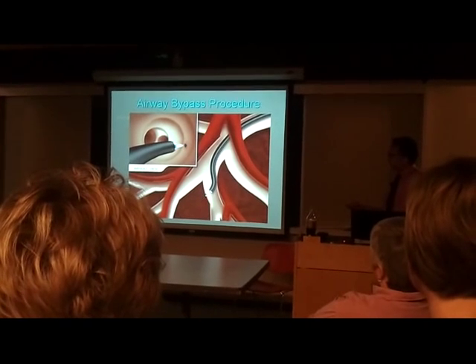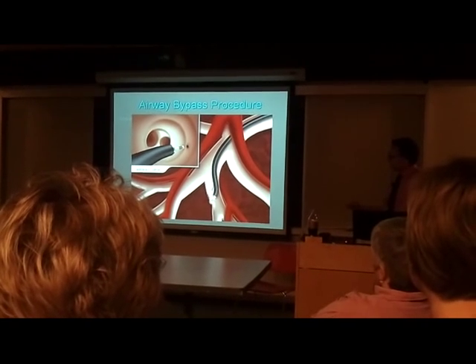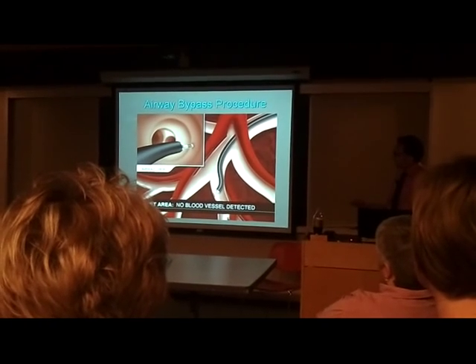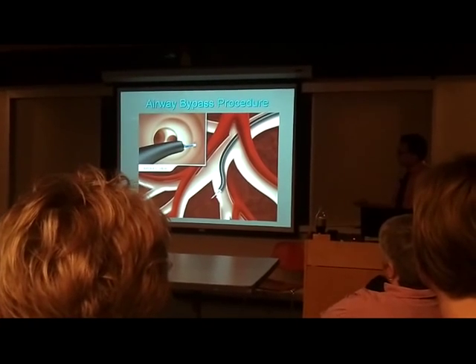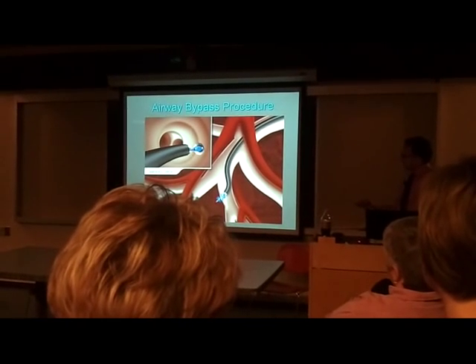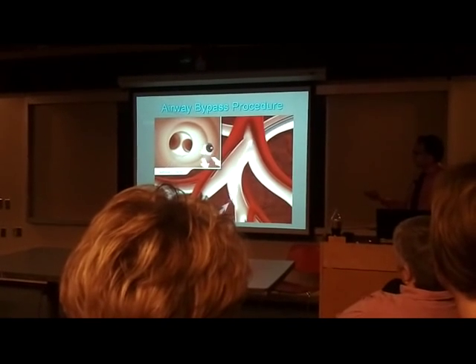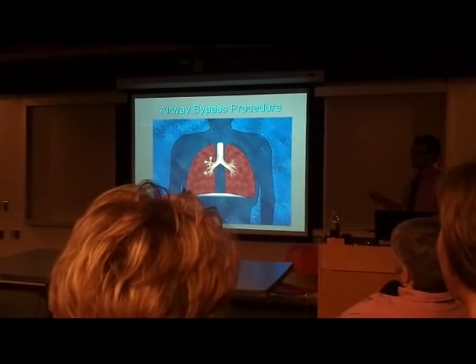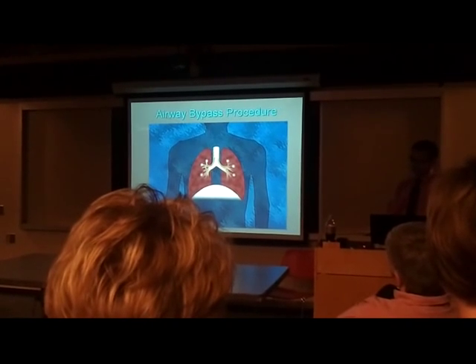There is a little stent loaded on a tiny balloon that you deploy and keep the airway open. You're doing Doppler again to make sure that hole is in the safe place and not near the blood vessel. So after the hole, you Doppler, and then you go ahead and inflate this balloon, which has a stent on it. Once you remove the balloon, the stent is deployed. And here's the artificial airway, which allows trapped air to come out. Now, because granulation is very easy in these tiny airways, these valves or stents were loaded with an antifibrotic agent. It was a very clever concept.